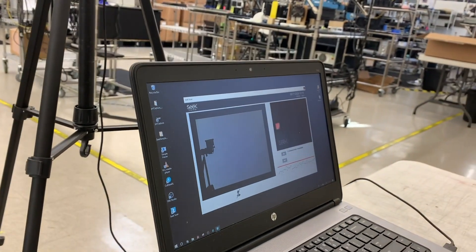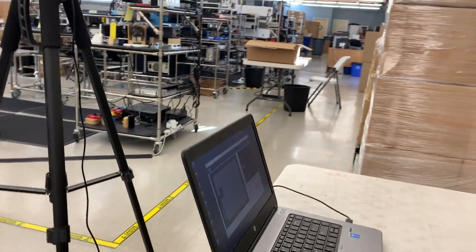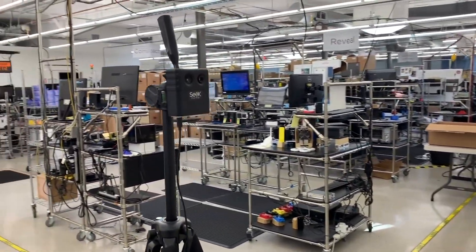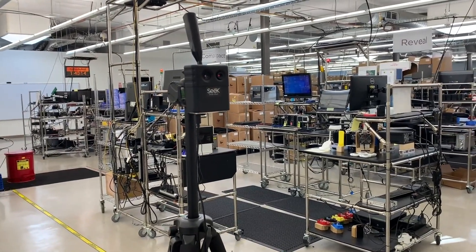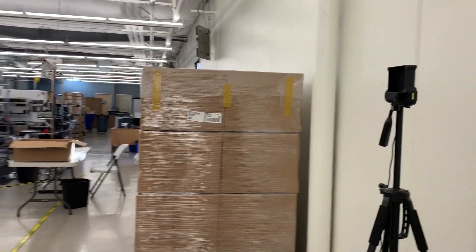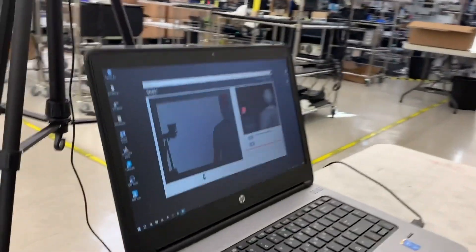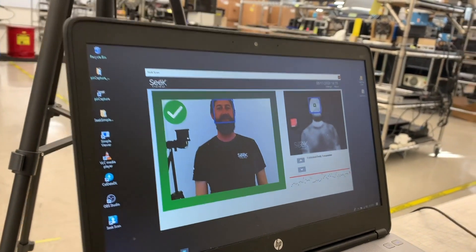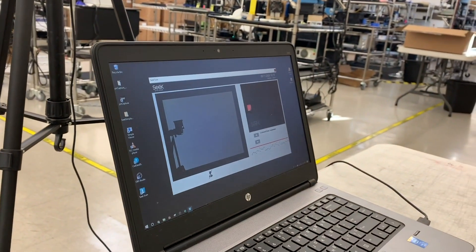In this particular setup we have chosen not to display any temperatures to the employees — they just want to know if they can pass or fail. So we'll show you how that looks as I step into the frame. The analysis gets done and you can see that the person passed and they can walk away.